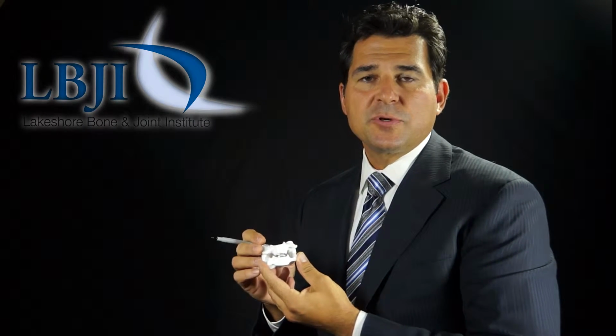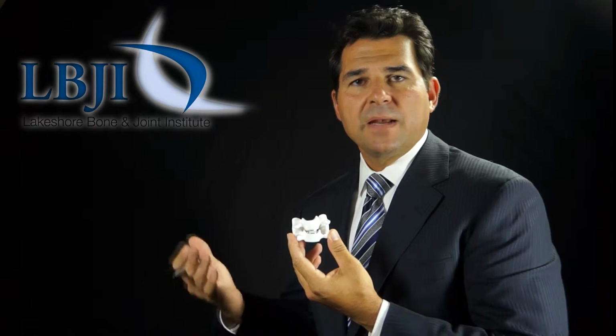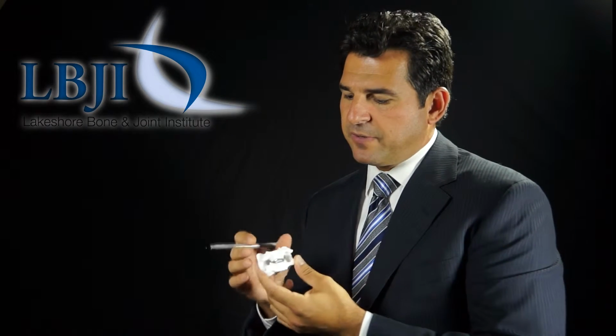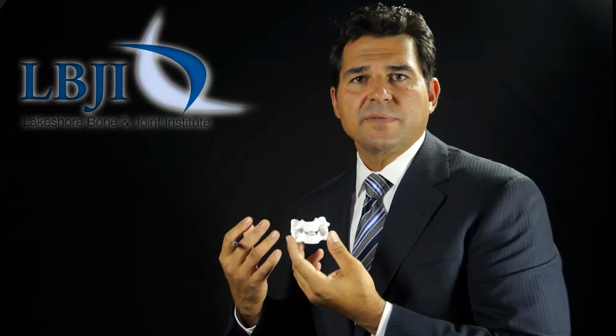Artificial disc replacement surgery is typically done on an outpatient basis, usually done in a hospital setting or can be done in a surgery center as well. In contrast to a typical decompression and fusion procedure, an artificial disc surgery doesn't require the patient to be in a collar for 6 weeks after the surgery.